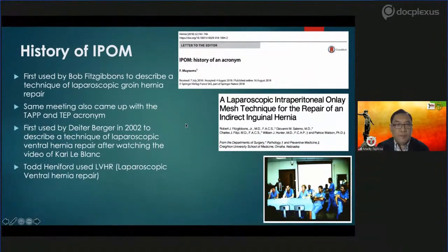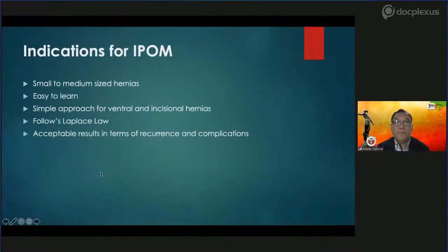So what about IPOM as the term for ventral hernia? This was first used by a German, Dieter Berger, in 2002, but he actually coined the term IPOM based on watching a video done by Carl LeBlanc as well. Todd, of course, reported his own series early on in laparoscopic hernia repair for incisional hernias, and he termed it LVHR for laparoscopic ventral hernia repair.